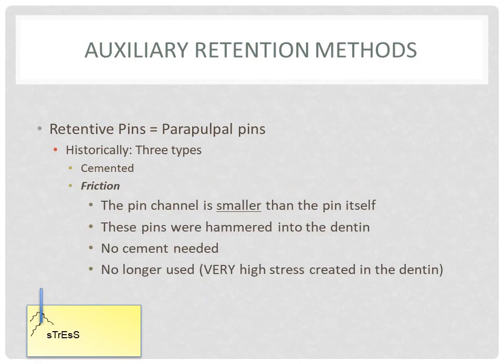In friction-retained pins, the pin channel is smaller than the pin. These pins are hammered into the dentin. Friction-retained pins are no longer used as the stress levels created, possibly leading to tooth fracture, are very high.